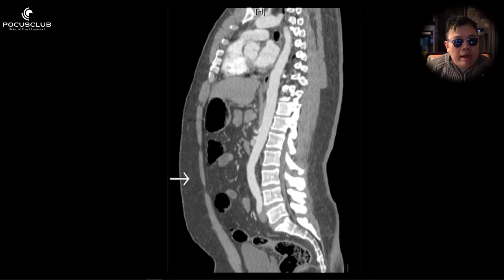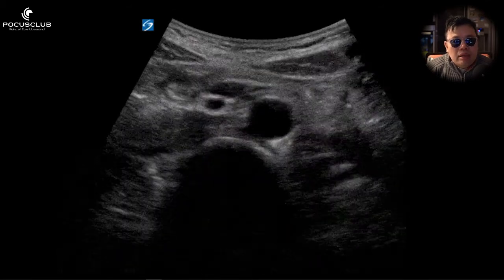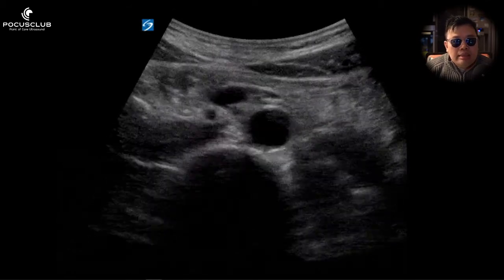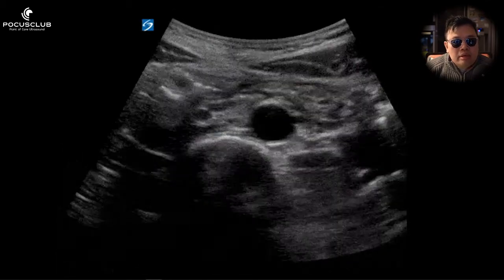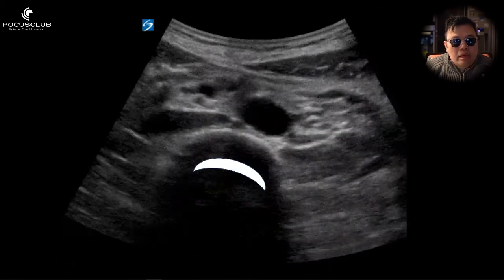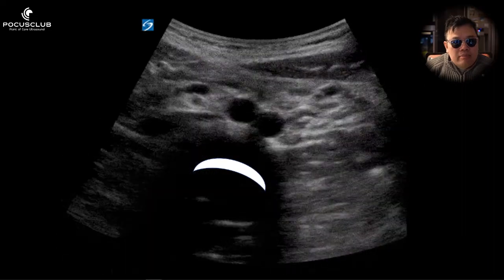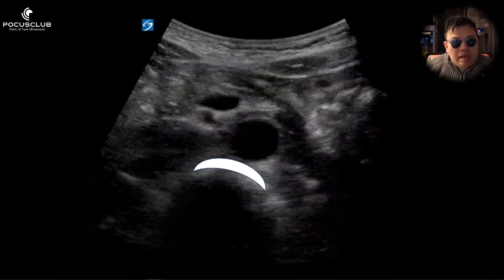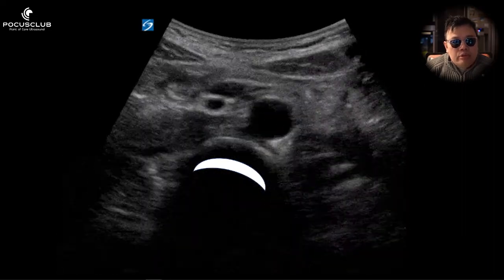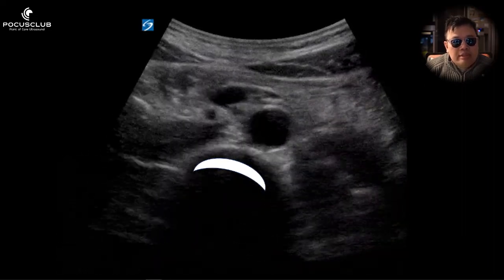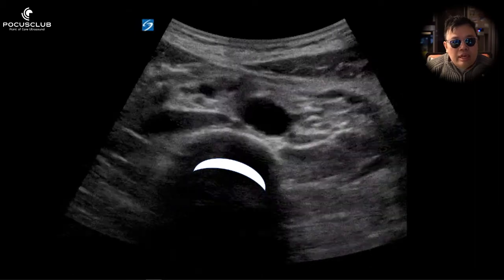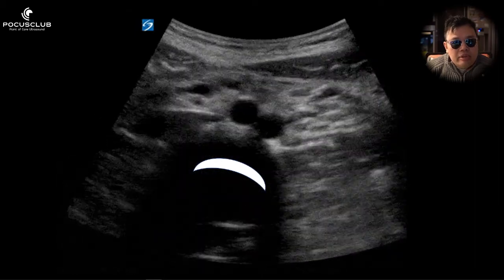So why don't we scan lower down? Why don't we start scanning from the belly button? See here? This is the vertebral body and posterior acoustic shadowing. This is really noticeable even in large patients.